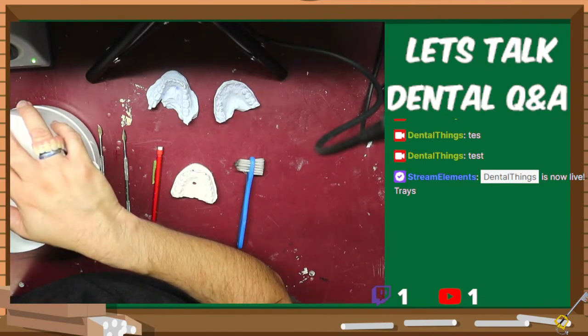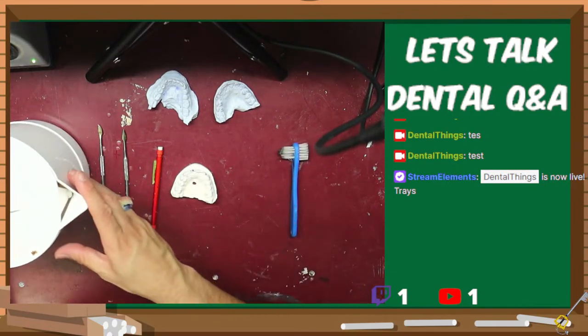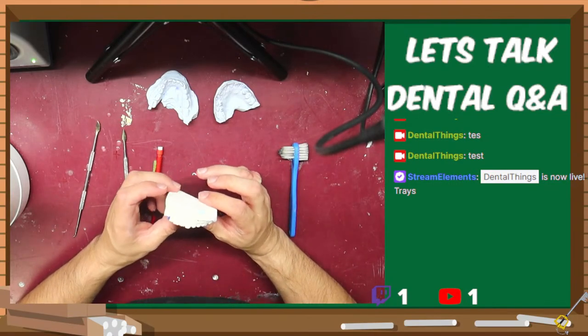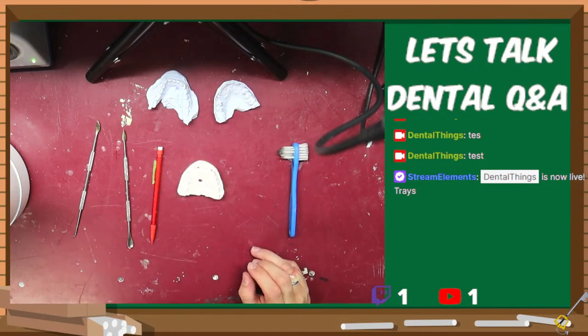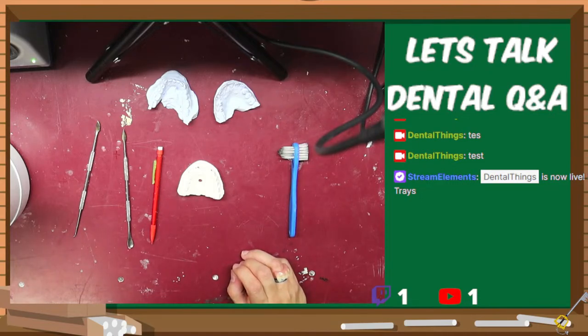That should be able to last long enough without power to be able to stay good. Pull that off to the side. And okay, I have this little spot, so I'm going to use some blockout resin to fix that.